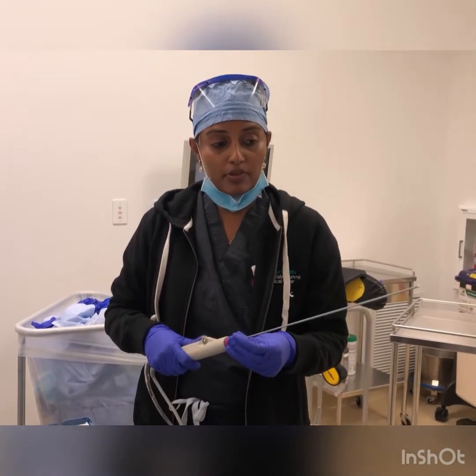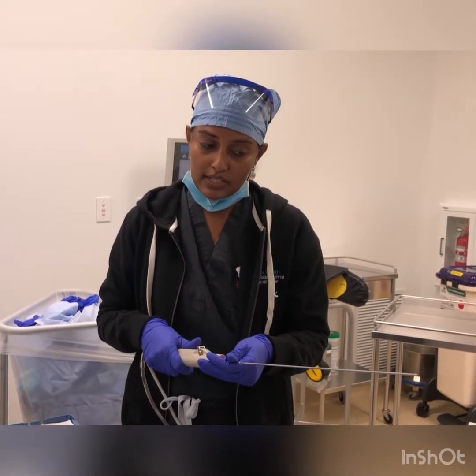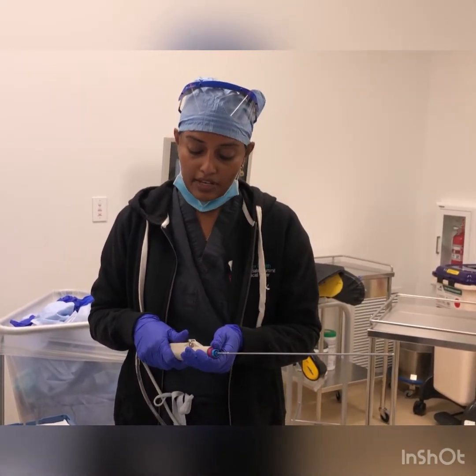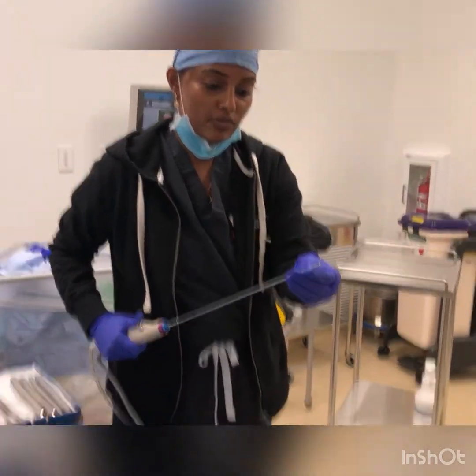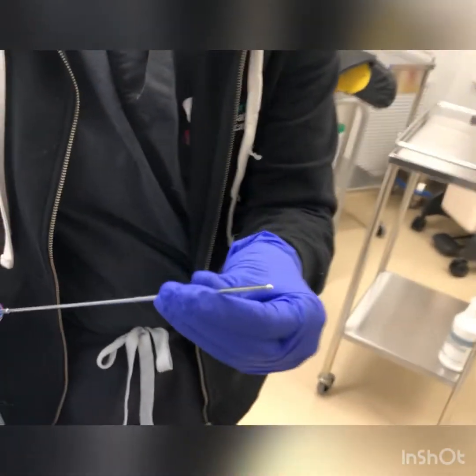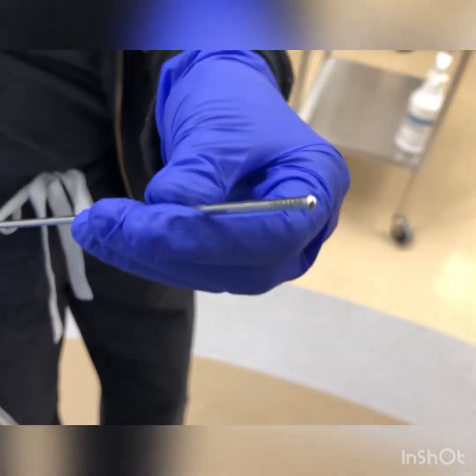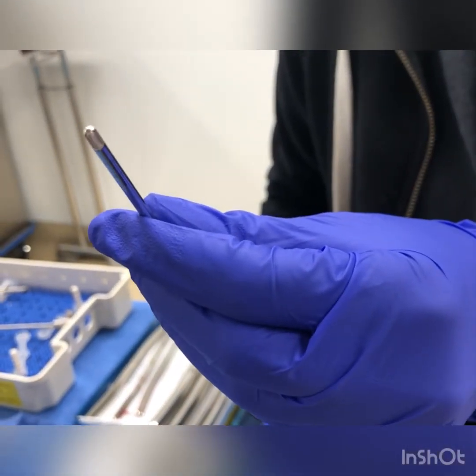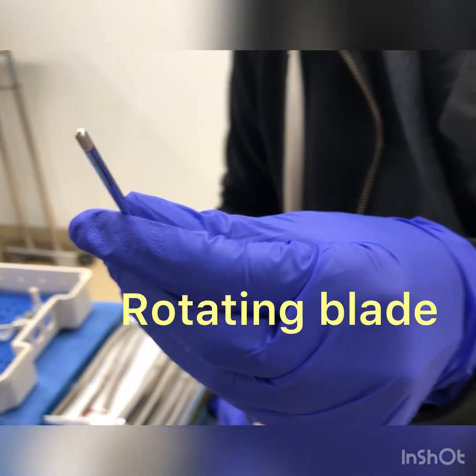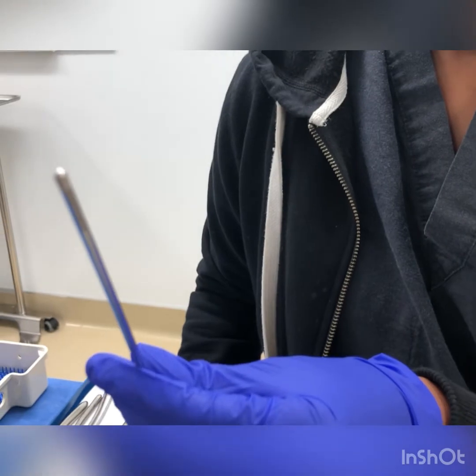I put this into my camera, and then I put the whole thing into the cervix, into the uterine cavity. If you come really close here, you can see, or maybe you can hear, how this blade moves. I press a pedal, and this blade moves and slowly can shave off a fibroid or a polyp.